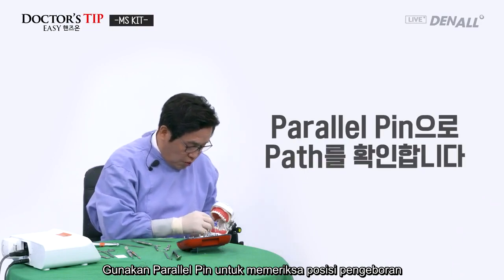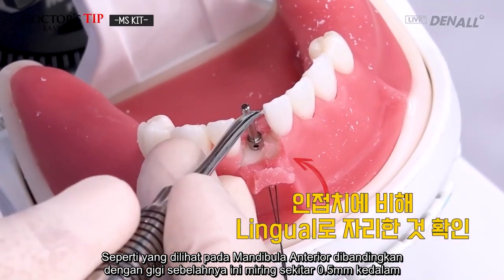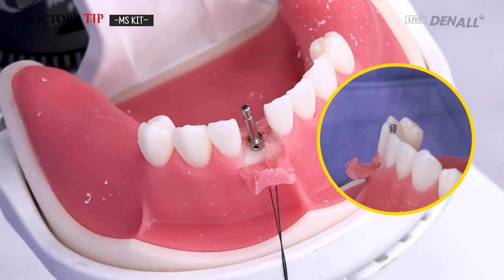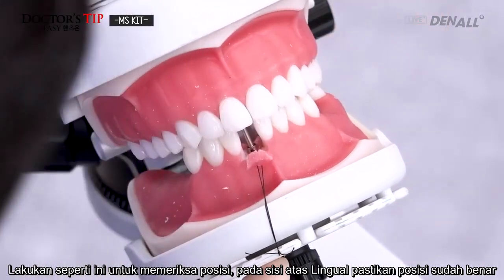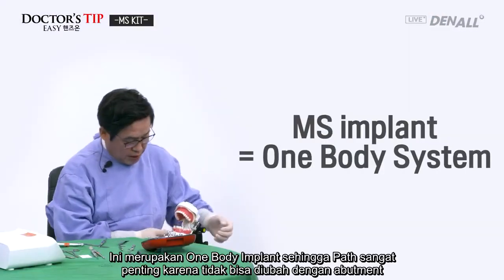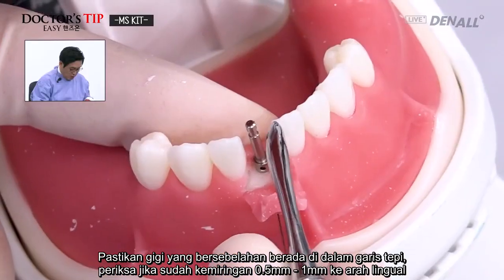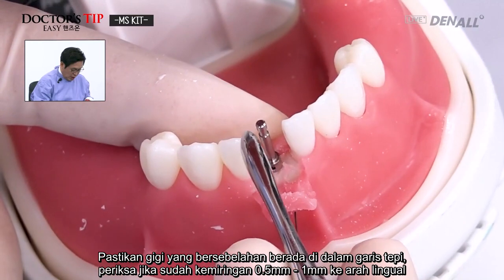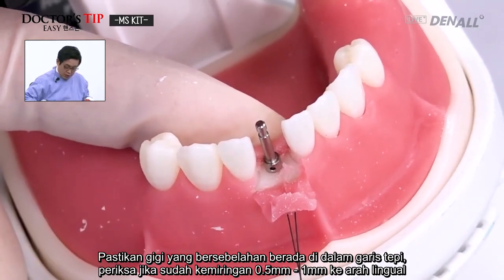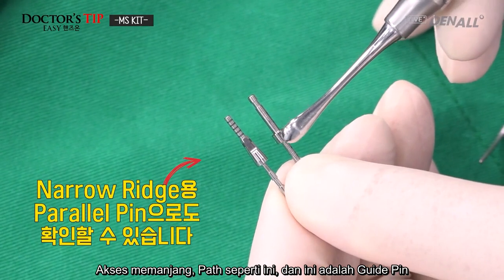I used a parallel pin to check the drilled position, and as you can see, on the mandible anterior side, compared to adjacent teeth, it's tilted about 0.5 to 1 millimeter toward the inside. And like this, you check the positioning, and on the upper side, on the lingual side, it's the correct position. And again, this is a one body implant, so the path is important because you cannot change it with an abutment. And like this, in the adjacent teeth, you check against the incisal edge line. So it's about 0.5 to 1 millimeter tilted toward the lingual, and on the longitudinal axis, the passage like this, and this is the guide pin.